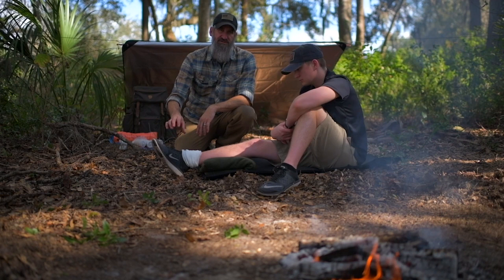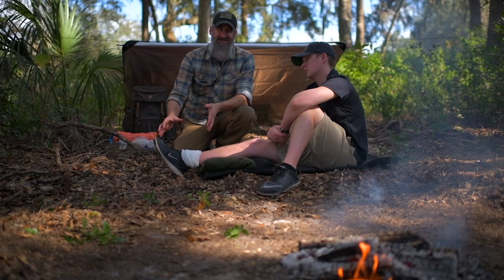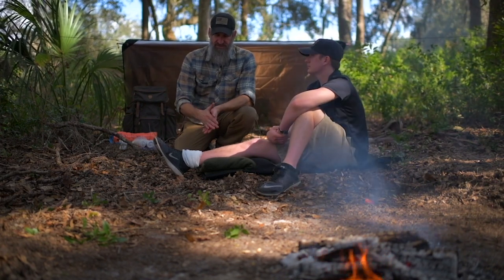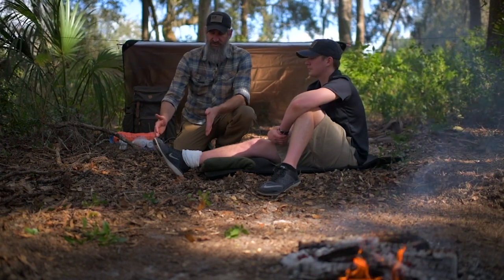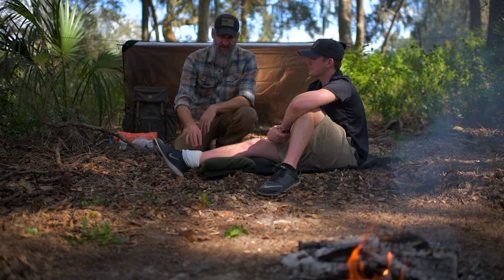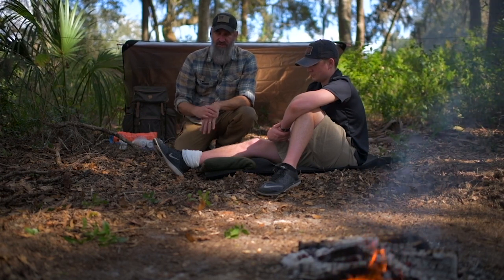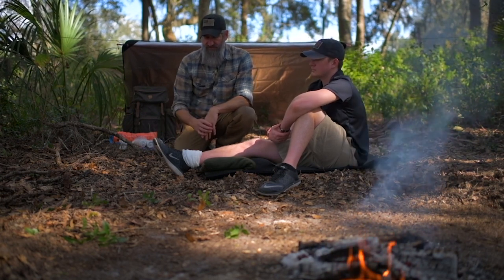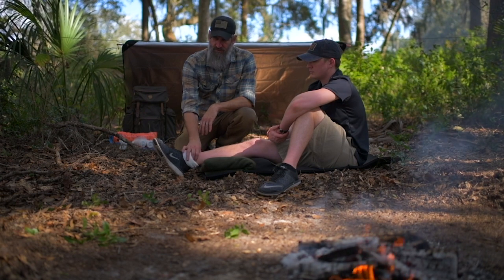There's a pedal pulse right behind the inside of the ankle bone — I should be able to feel the arterial pulse there, and I do. If you don't have access to any of that, checking motor function and sensory function is reasonable: if he has motor and sensory function, you can expect he also has circulation. You need to assess CMS before you put a splint on, and reassess afterwards to make sure you didn't interfere with circulation, motor, or sensory.